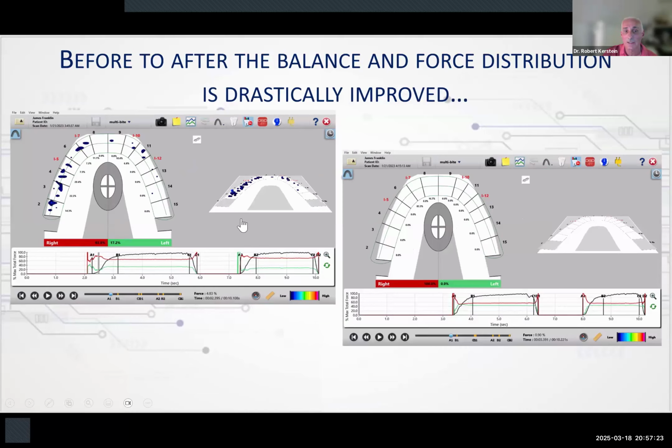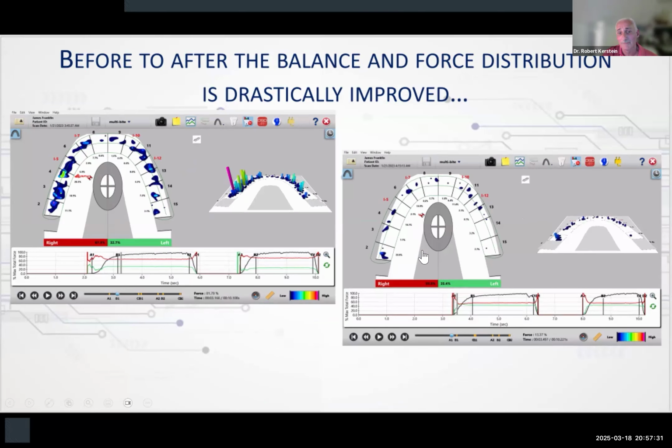Here's how it started. And this was in a training where I was in an office with a dentist teaching them how to use the T-scan. And this is what we corrected it to. Look how quickly the center of force comes to the middle. Look at the low force uniformity. The balance is hovering around 50-50, right? You could take a little bit off of these two contacts, but this is a far more improved outcome, right? And again, you couldn't tell this kind of distribution from the paper marks.